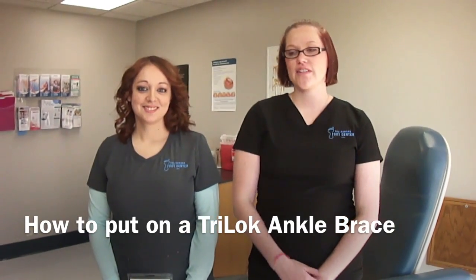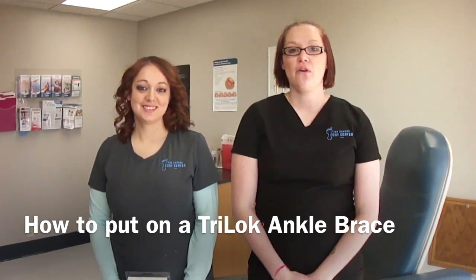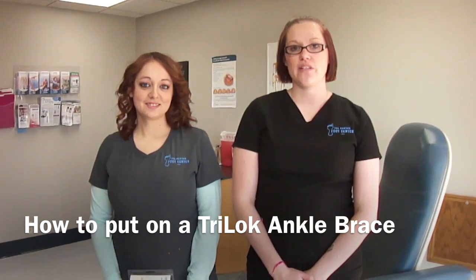Hi, my name is Charlotte and alongside me I have Ashley here. We're with the Kansas Foot Center with Dr. Truong and Dr. Lewis. We're going to show you how to put on a tri-lock brace today.